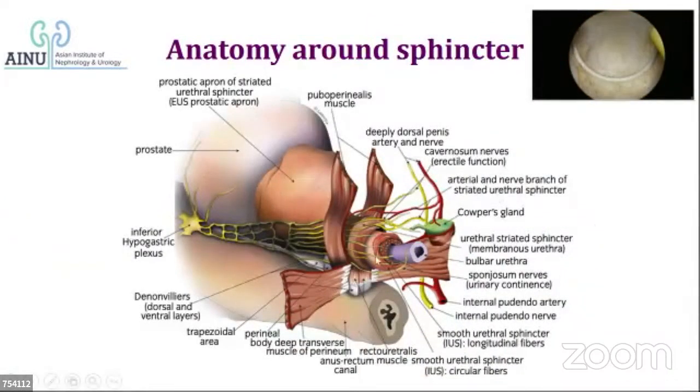And the same thing is depicted from a lateral aspect, in relation to the radical prostatectomy, wherein all the nerves are there between the external urethral sphincter and the pubourethralis muscle sling. All these external nerves which go to the levator ani muscle are there.